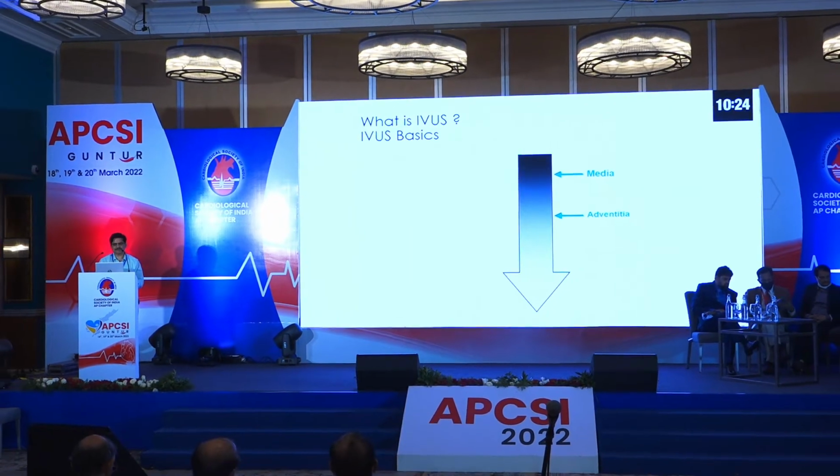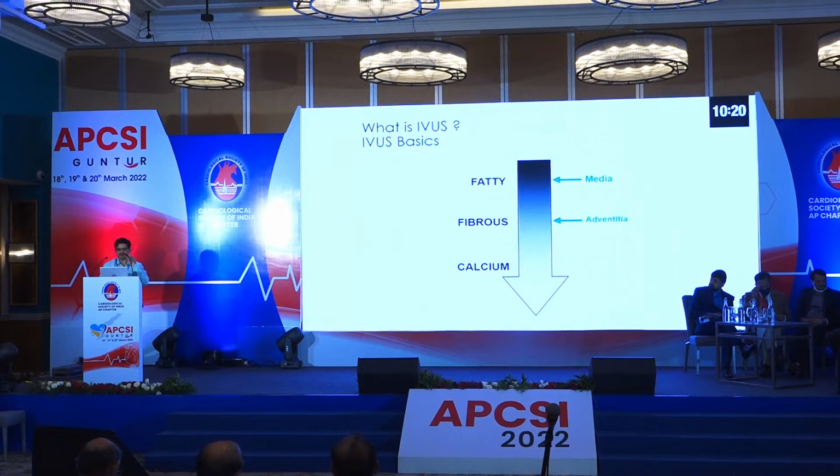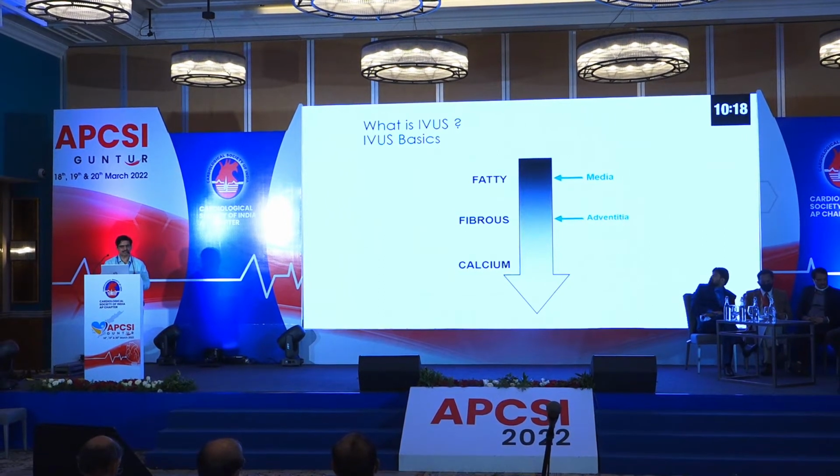So these are some of the basics, where you can see that fatty plaque is echo-lucent, fibrous plaque is echo-bright, and calcium has a milky white appearance.